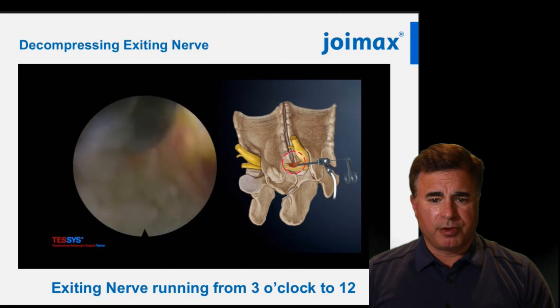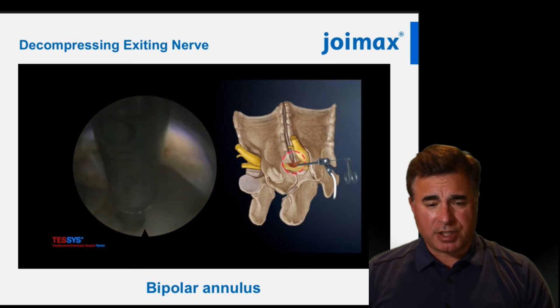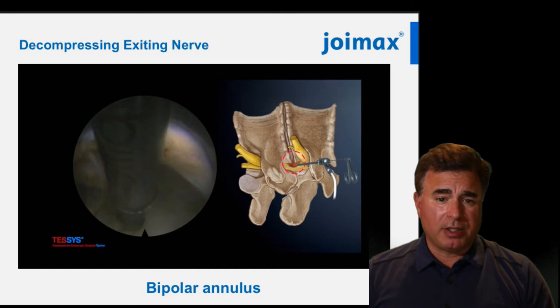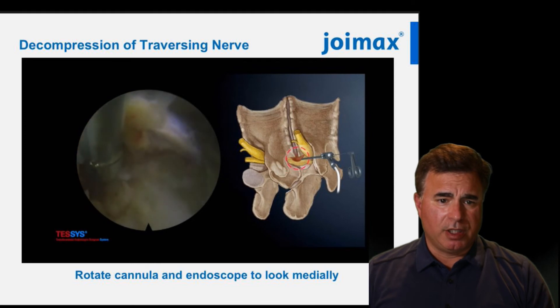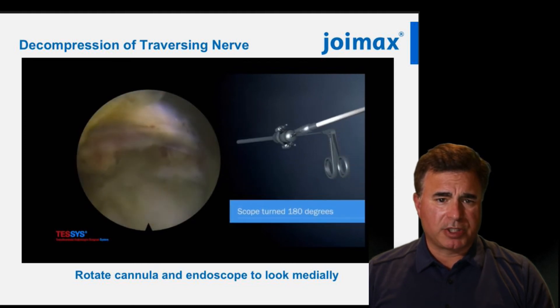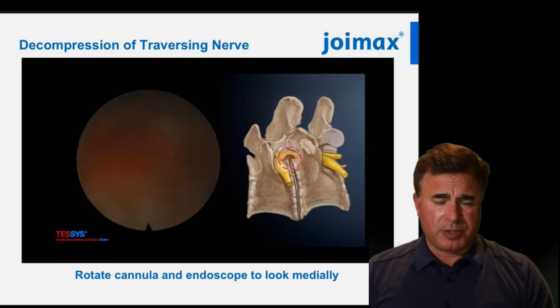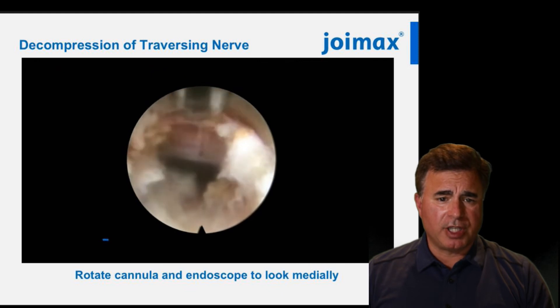In this video the exiting nerve root is running from 3 o'clock to 12 o'clock, and here the surgeon is bipolar in the annulus. There's really nothing pressing on the exiting nerve root at this point — if this were a far lateral discectomy or an extra-foraminal disc herniation, surgery would be over. However, if the disc herniation extended more medially or this was a paramedian disc extrusion, you would want to look into the spinal canal by rotating the cannula and endoscope. Here you'll see some disc material being removed, and when it's removed you'll see the pulsating dura and be looking underneath the traversing nerve root — a unique perspective that only transforaminal endoscopic surgery provides.